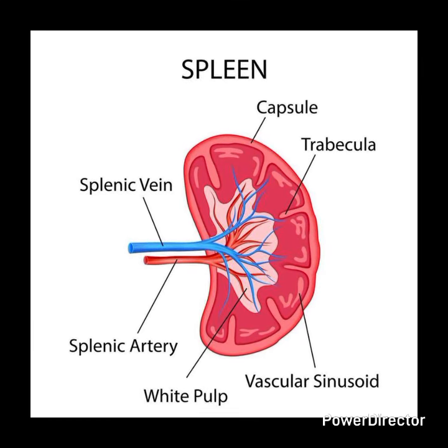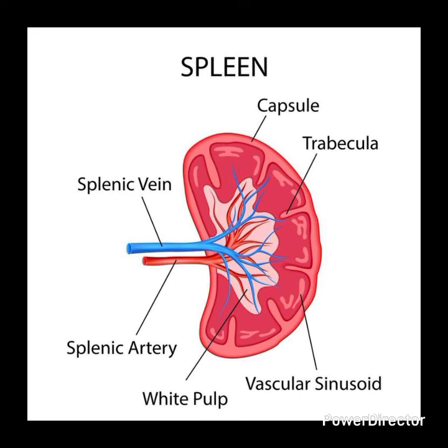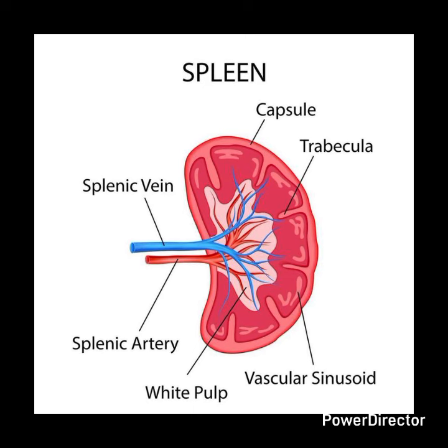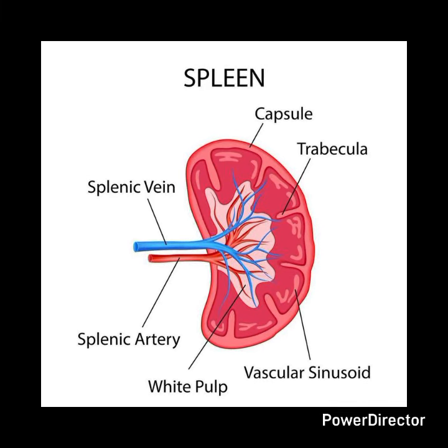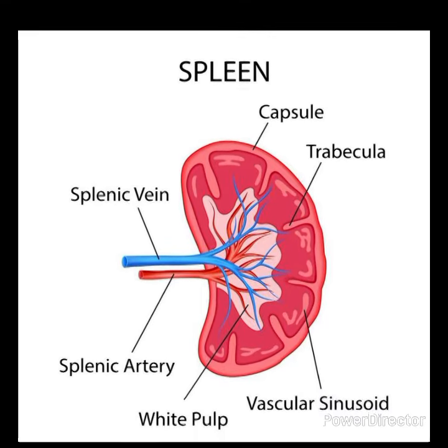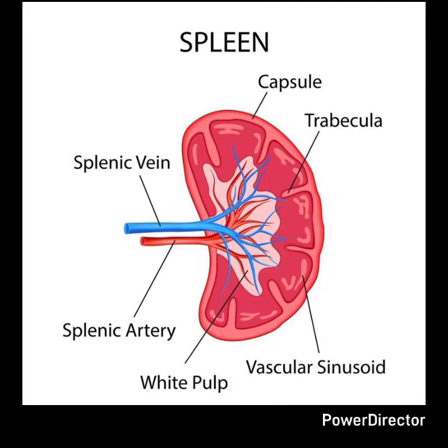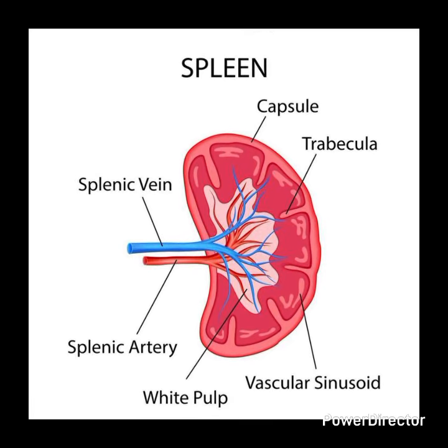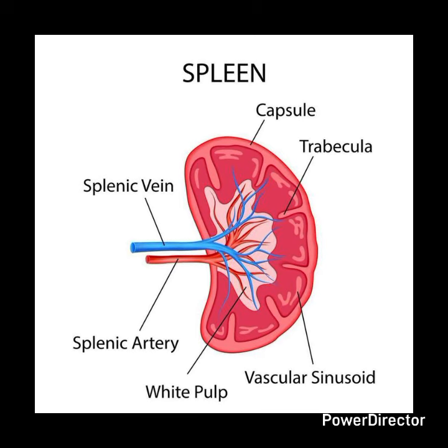It involves occluding the main splenic artery, typically between the dorsal pancreatic and pancreatica magna arteries, using coils or vascular plugs. This procedure reduces arterial pressure to control bleeding while maintaining splenic perfusion. The splenic perfusion is maintained through collateral pathways like short gastric, pancreatic and gastroepiploic arteries, preferred for multifocal injuries or high-grade trauma. Next one is distal splenic artery embolization.